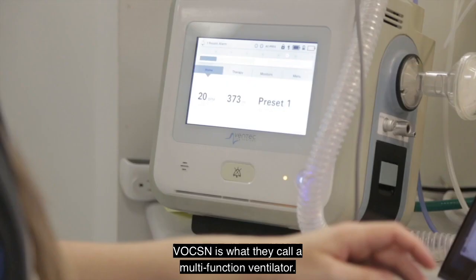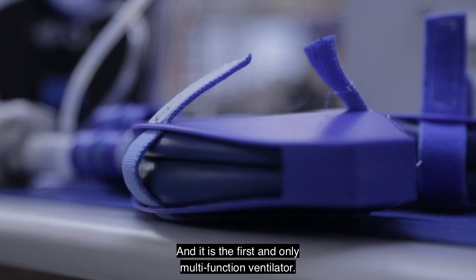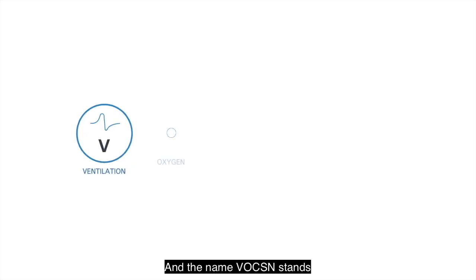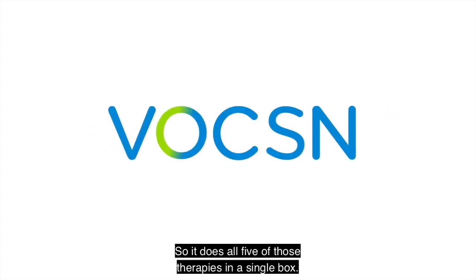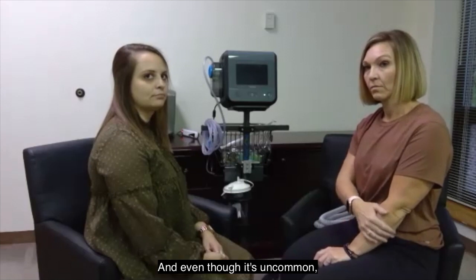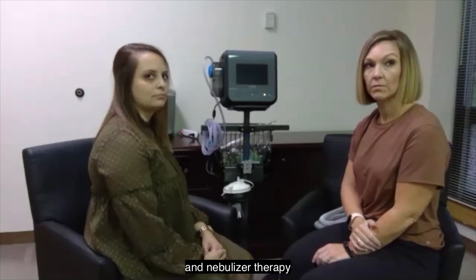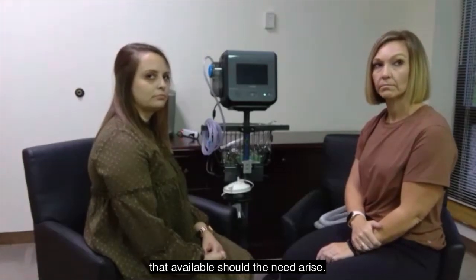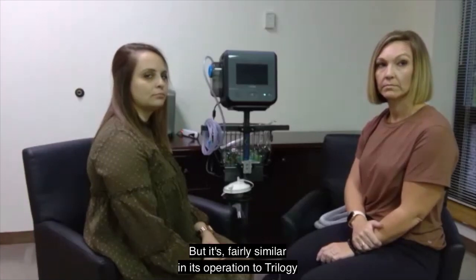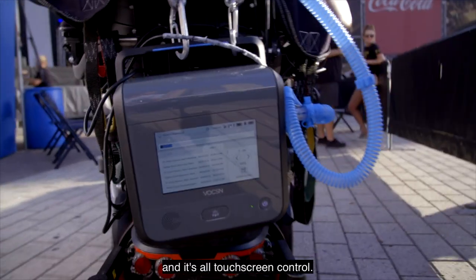VOCSN is what they call a multifunction ventilator. It is the first and only multifunction ventilator. The name VOCSN stands for ventilation, oxygen, cough, suction, and nebulizer — so it does all five of those therapies in a single box. Even though it's uncommon in ALS, it does have the ability to provide supplemental oxygen and nebulizer therapy, which is certainly advantageous should the need arise. It's fairly similar in its operation to the Trilogy, but much easier in terms of cough and suction because everything is integrated and touchscreen-controlled.